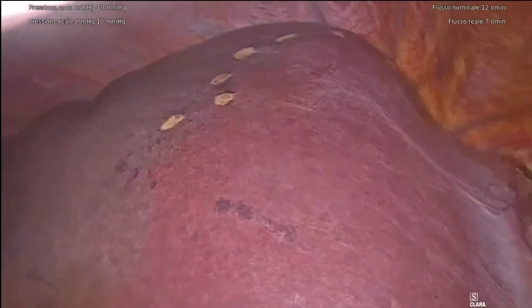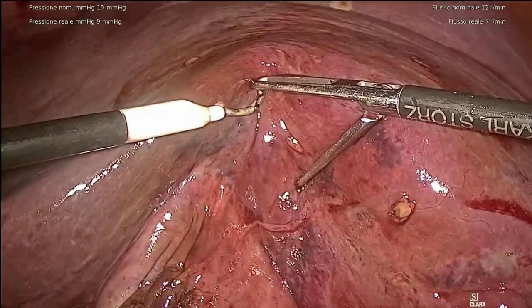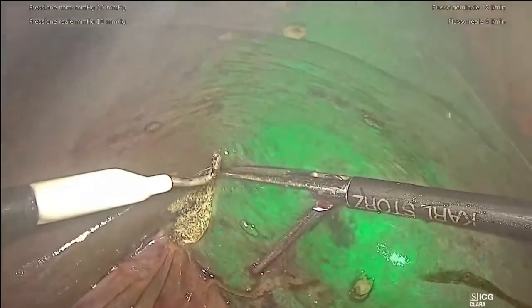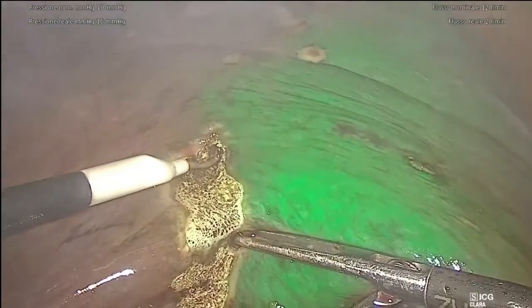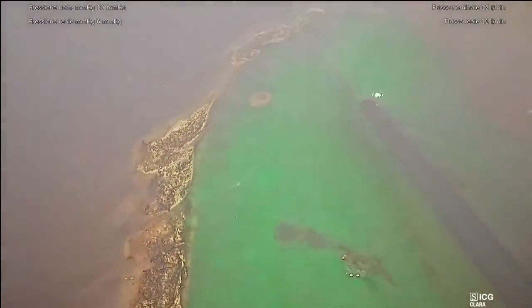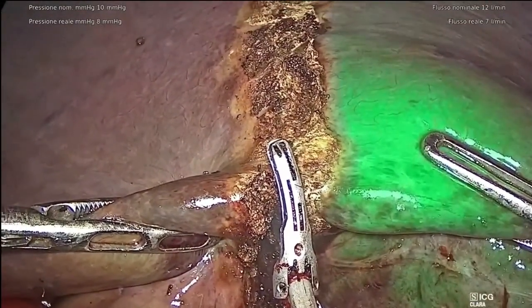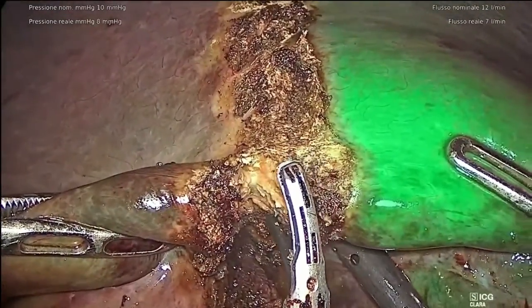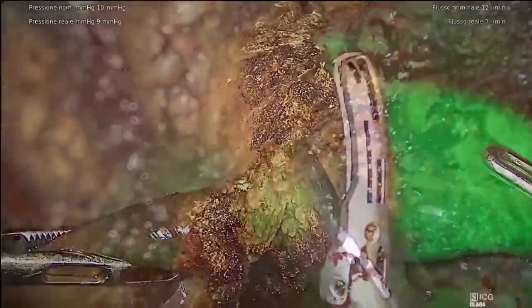After a deep ultrasonic assessment of the tumor's relation to major vascular structures and especially to the middle hepatic vein, the key structures are marked with diathermy on the capsule, and with the help of ICG green, a correct transection line along the so-called Cantlie line is painted on the surface of the liver. Here, as you can see, with the ICG green help, the liver demarcation is stressed.